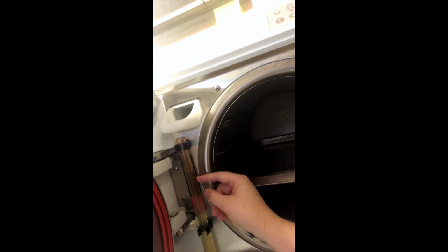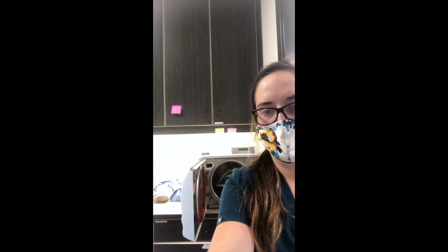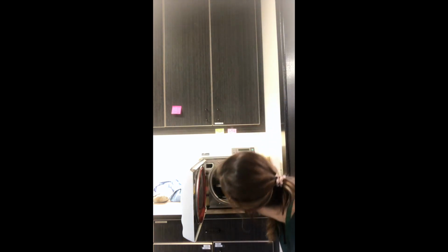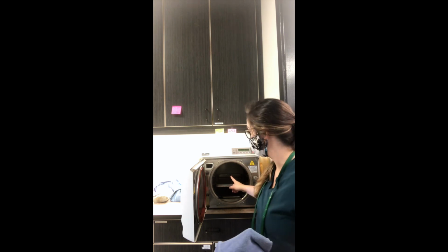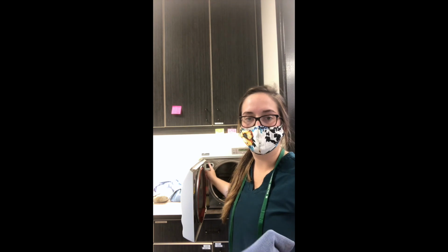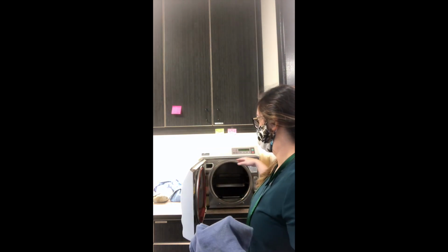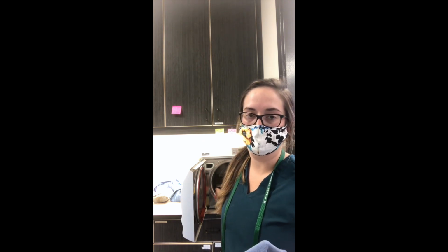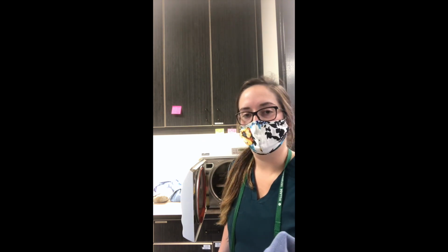And then you also want to, on a weekly basis, drain the machine. So you would pull this tube out, drain it into a bucket, and then refill the reservoir with distilled water. On a monthly basis, you do the same thing, as well as clean the filters on the inside of the autoclave, and then run speed clean through on an actual cycle, and follow that with a rinse cycle of distilled water, and let that cool.